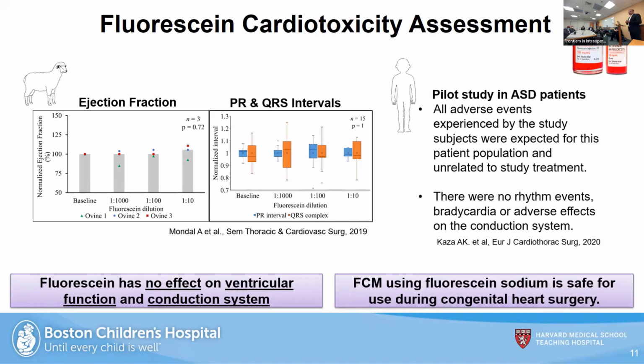In our pilot studies, we did record all the adverse events that the patients underwent. All adverse events experienced by the subjects were expected for this patient population, and none of them were associated with the study treatment. And there were no rhythm events recorded in these patients. Hence, establishing that FCM using fluorescein dye was safe for use during congenital heart surgeries.